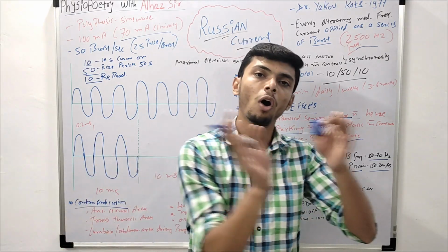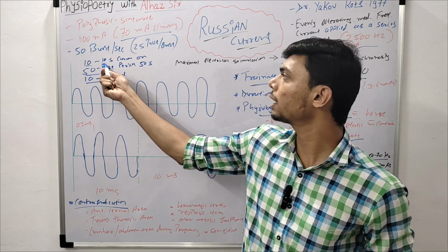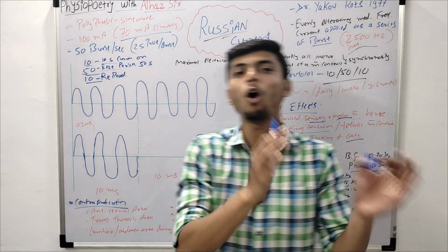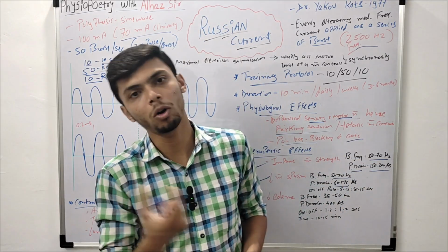That therapy is getting delivered to the skin of the patient, so that time duration is known as the on period. If I am talking about a 60-second cycle, and 10 seconds is the on period, it's the on portion. The 50 seconds is the off period. So the on-off ratio we will say is 10 seconds on and then 50 seconds off. This is an on-off ratio.